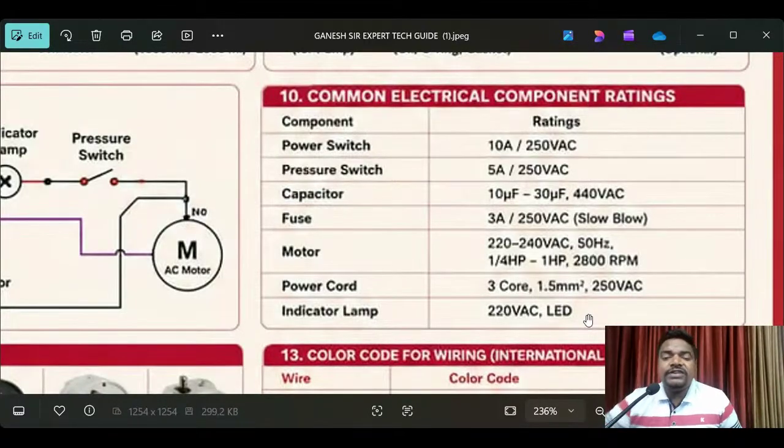These are very, very important basic points, and this is why I'm giving all these things within a fraction of minutes. So you have to keep multiple equipment in your mind, and see, when you want to become a specialist in any medical equipment, troubleshooting is important, operation is important, specification is important, principle is important. Okay, and what accessories and what components are important. If you know all these things, then only can you do the services, and you can provide the services instantly, right? Come on.